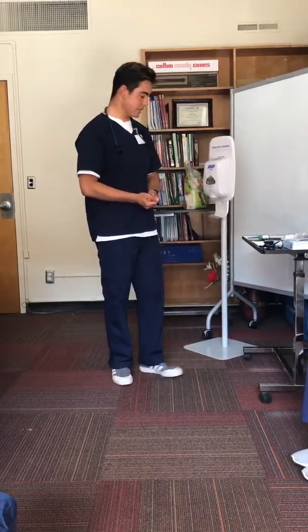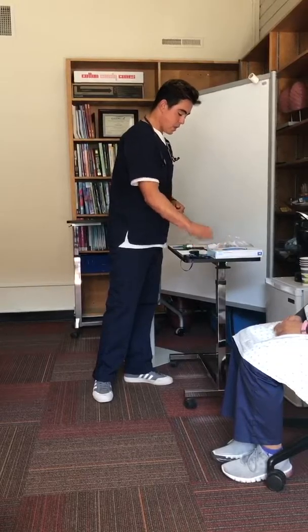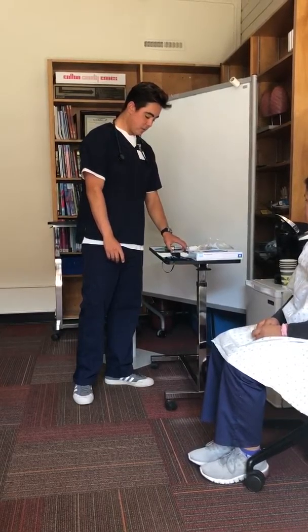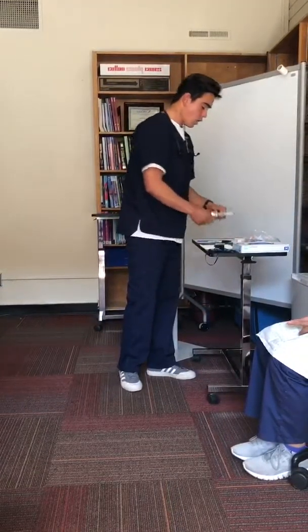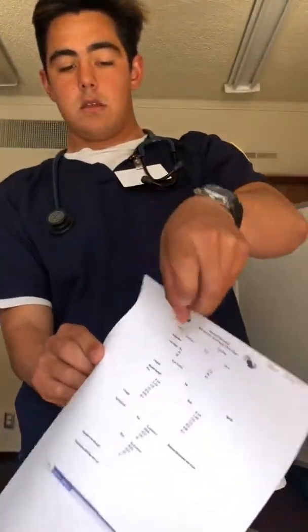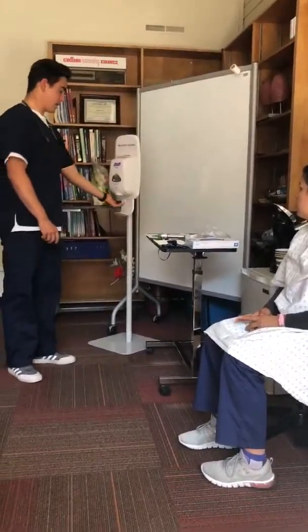So for frequency. After that, we're going to go ahead and gather our supplies. So we want our pulse oximeter, we want our stethoscope, our PPE, our unit dose albuterol, napkin to cough into later, our disinfecting wipes for our stethoscope, our peak flow meter, as well as the peak flow chart to determine the predicted flow rate, our oxygen wall mount, our recording utensils, as well as our flow sheet to record on with nothing on it. We have our calculator to do these calculations, as well as our hand sanitizer.